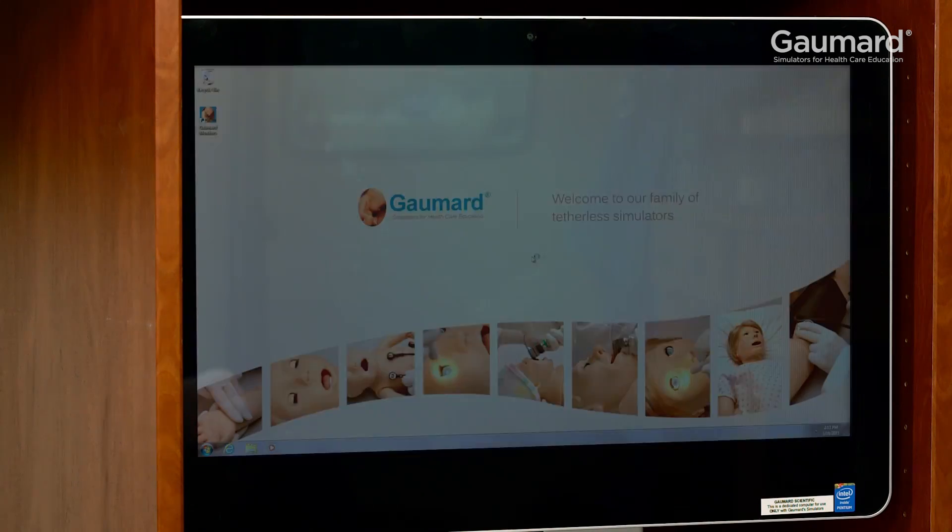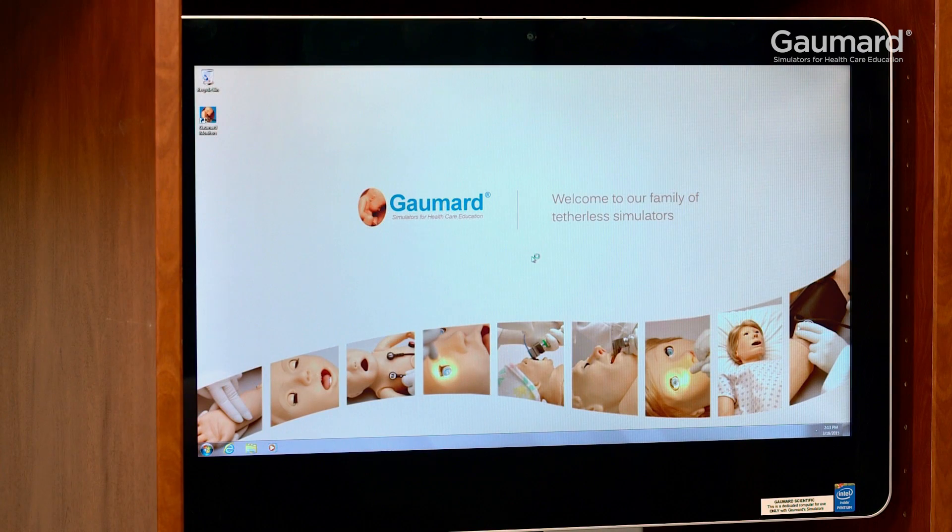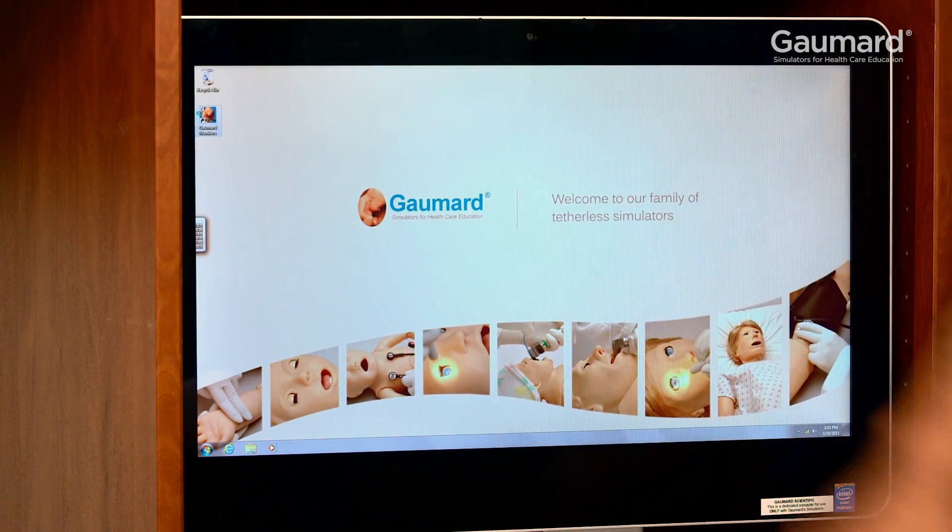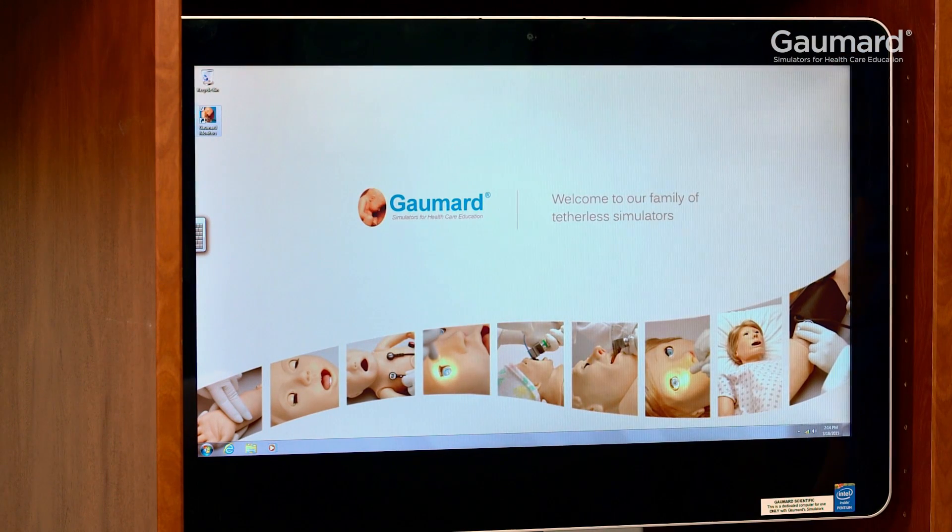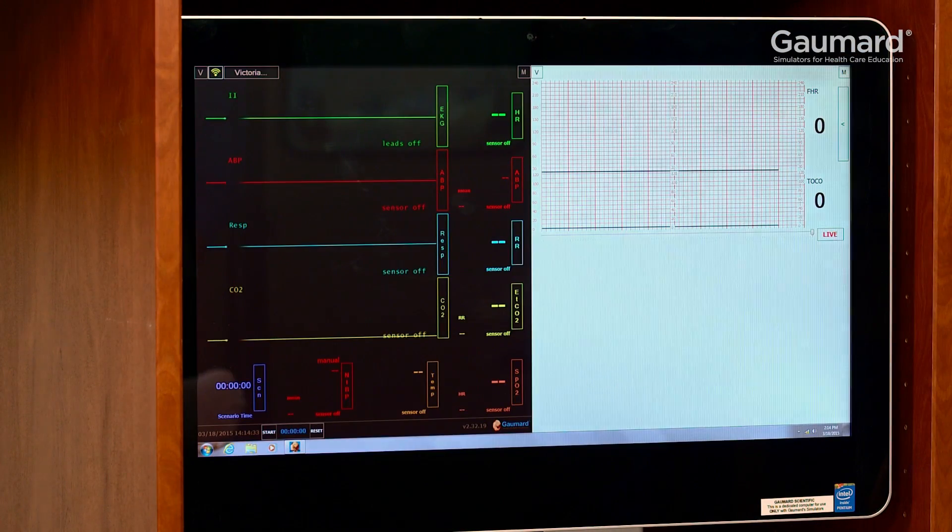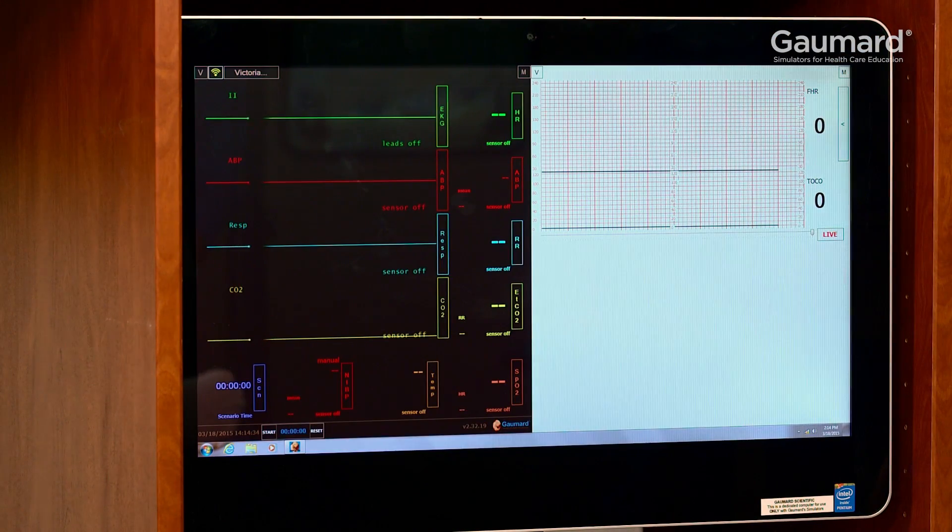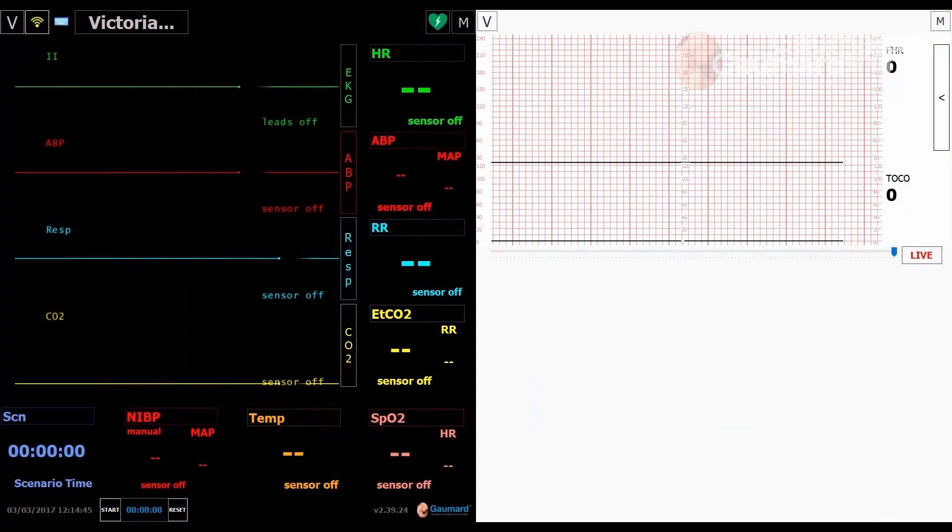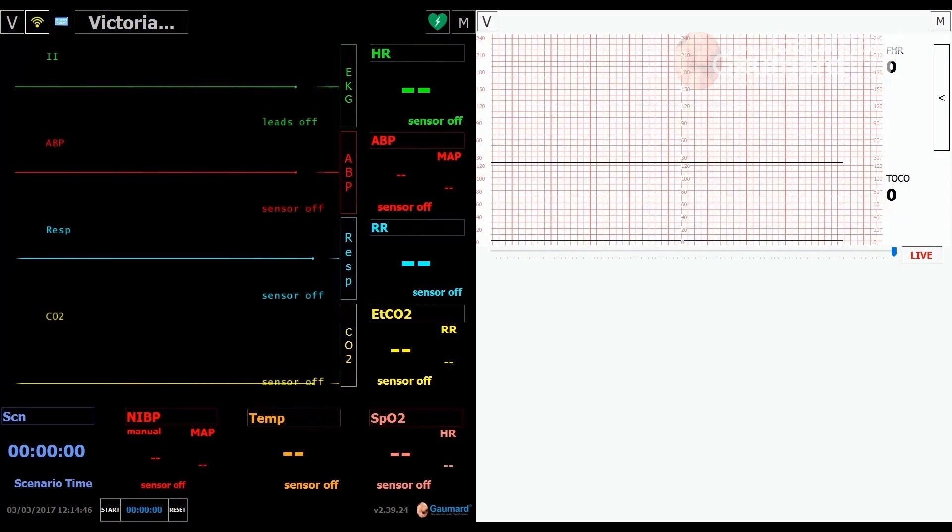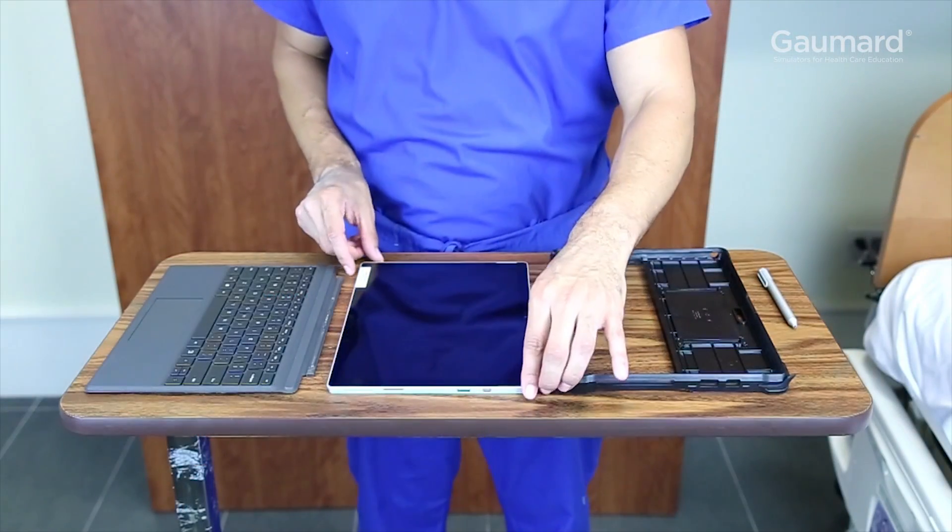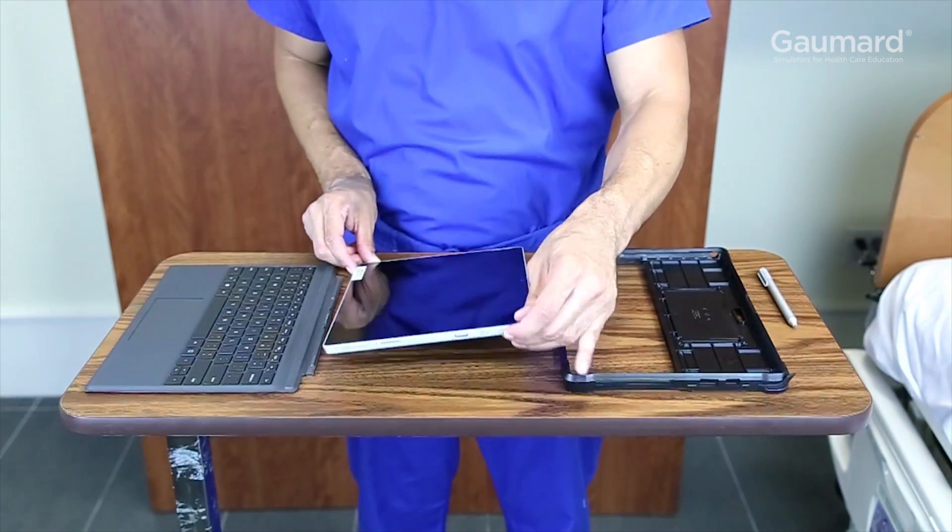Once the bedside monitor is on, double-click the Gaumard monitors icon. The monitor program will open, but no vitals will display until Uni is opened and communication is established between the programs.